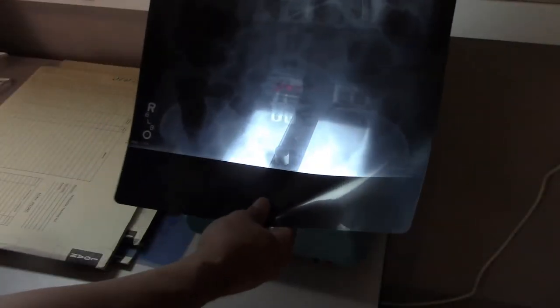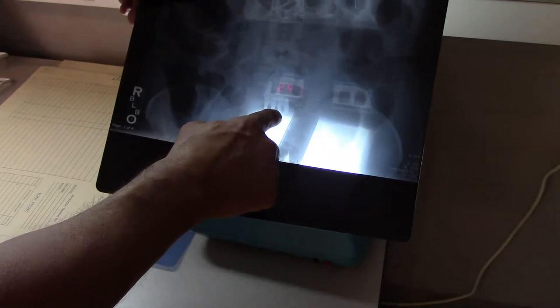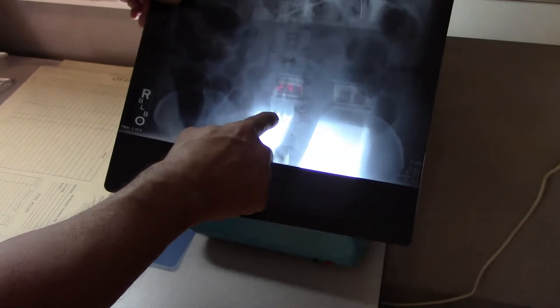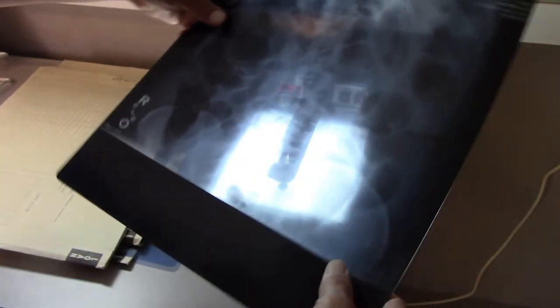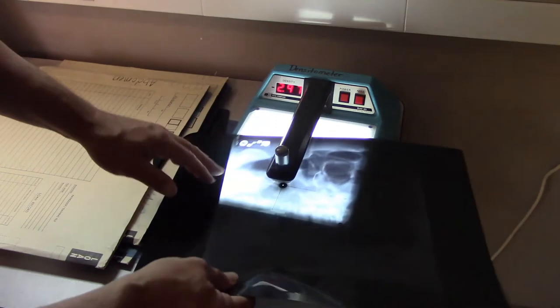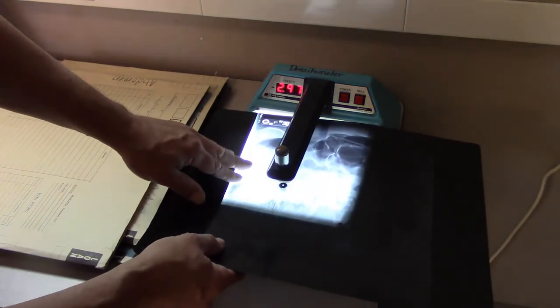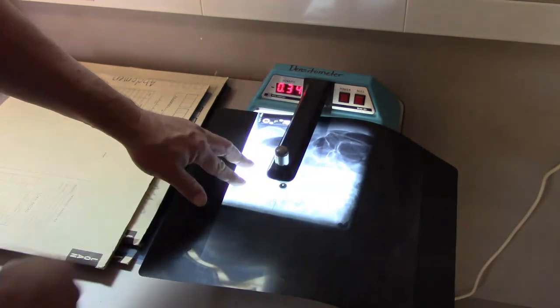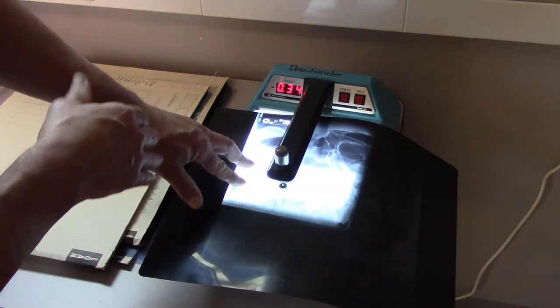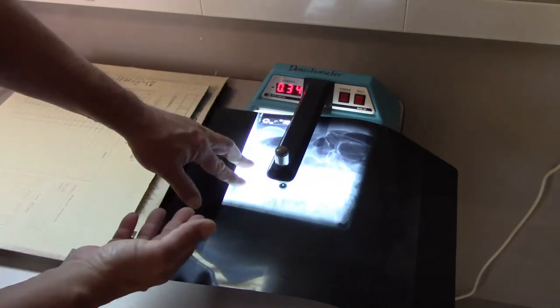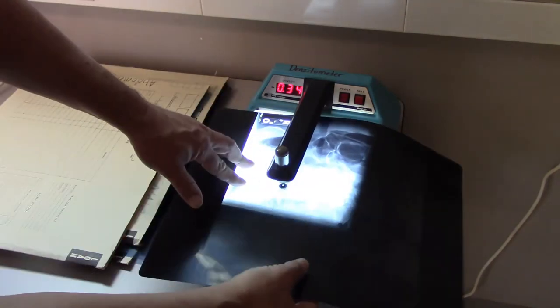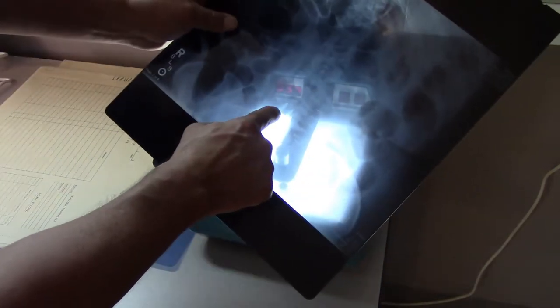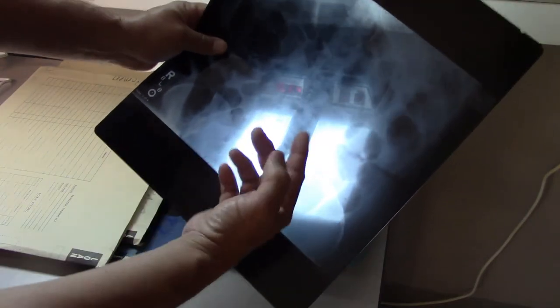Now let's take an area of the image that is very very light. You see this surgical hardware right here? It looks like some kind of a stapling device for the lumbar spine. Let's measure it and see what it looks like. If we put that in our crosshairs and make our measurement, that's a 0.34. So in this case, almost all the light is getting through, which makes sense because see how light that is? Any light that hits this is going to pass through basically unimpeded.